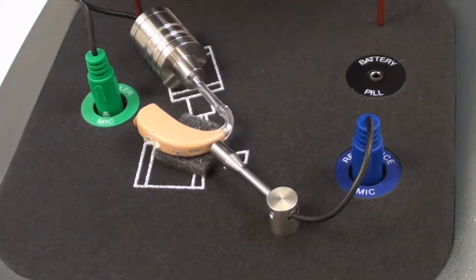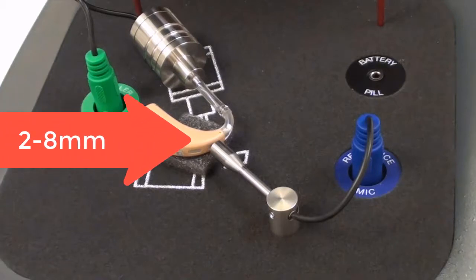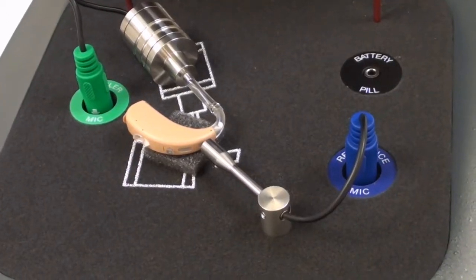Position the hearing aid so that the center of the sound inlet of the hearing instrument microphone is between 2 and 8 millimeters from the reference test microphone.